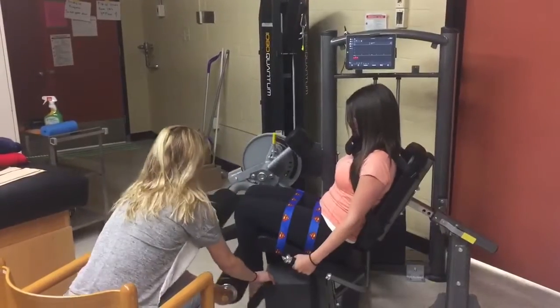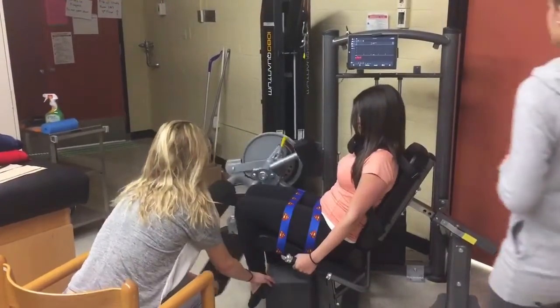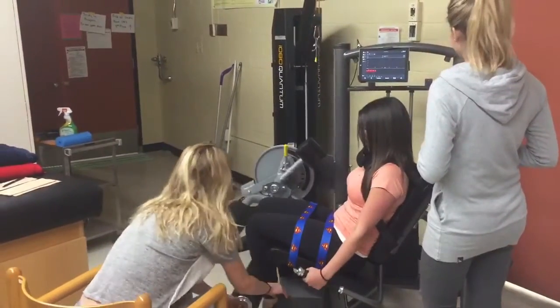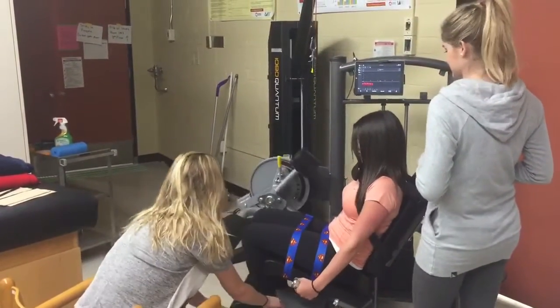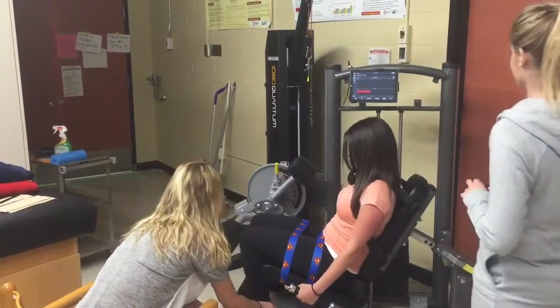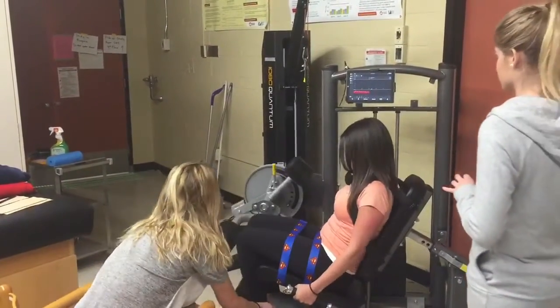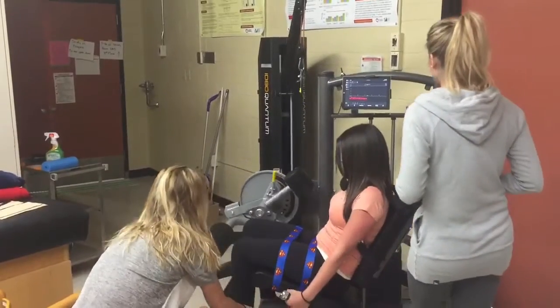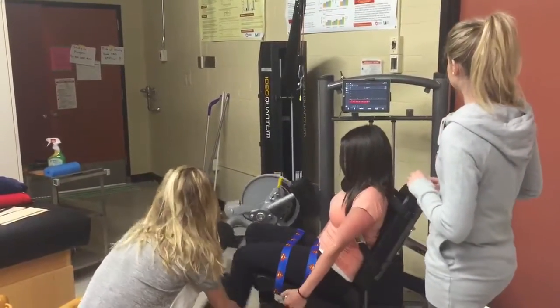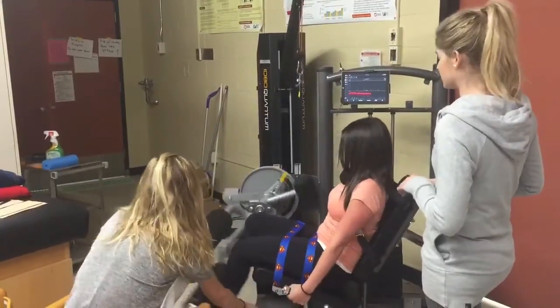Good job, Fatima. Let's go! There you go. Keep going. You got this. Five more. There you go. Two more. Last one.